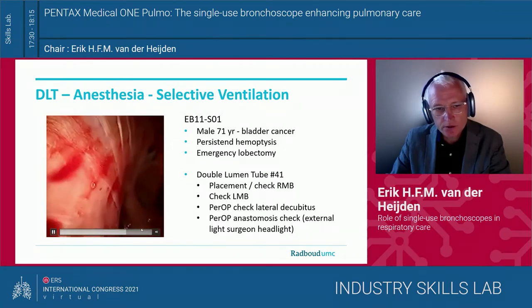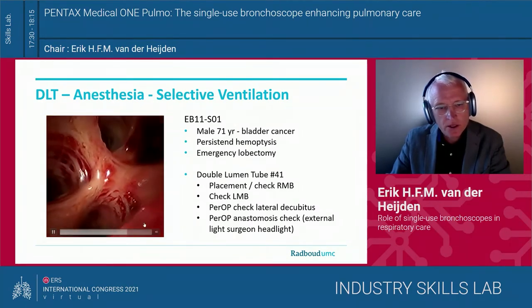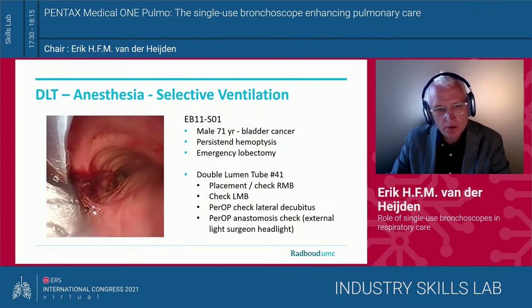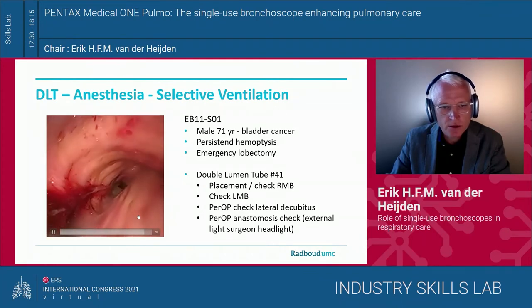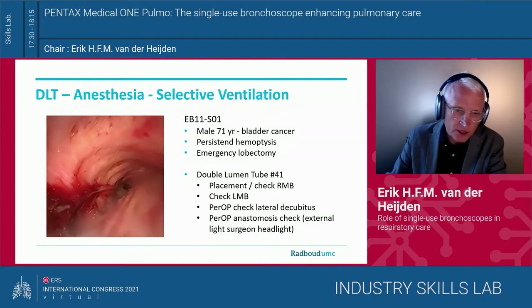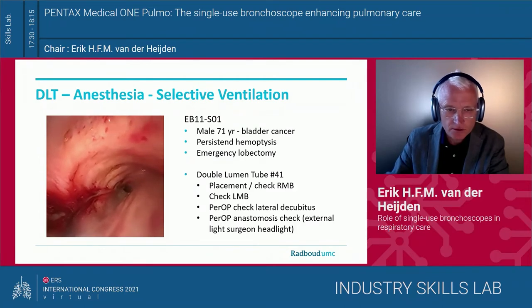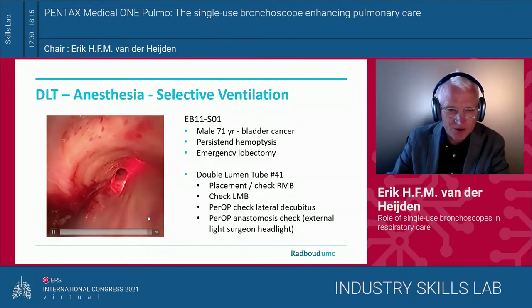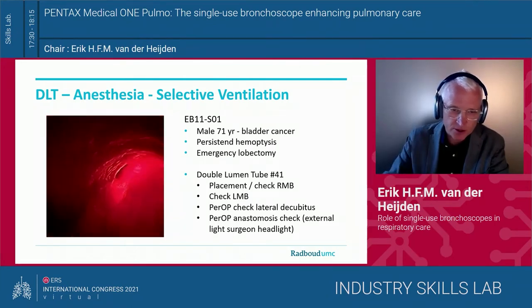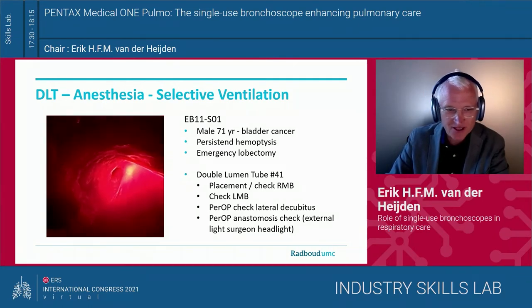This is in preparation during the bronchoscopy or during the surgical procedure. And a bit further to the end, you can also see how it looks when the thorax is opened and the surgeon is looking to the end of the scope with headlights on, so the illumination is automatic. Here's the headlight of the surgeon coming up, and it shuts down your own light. So you need to tell the surgeon, well, switch off your lights because I can't see anything anymore.